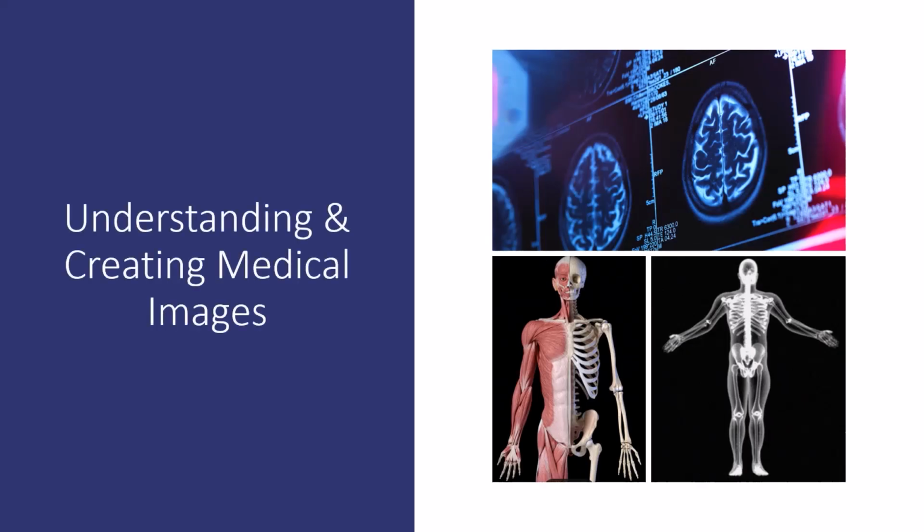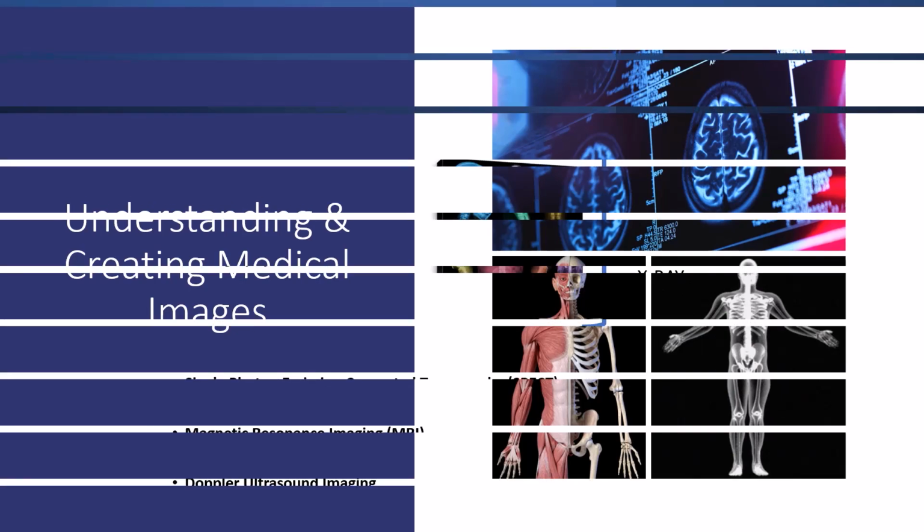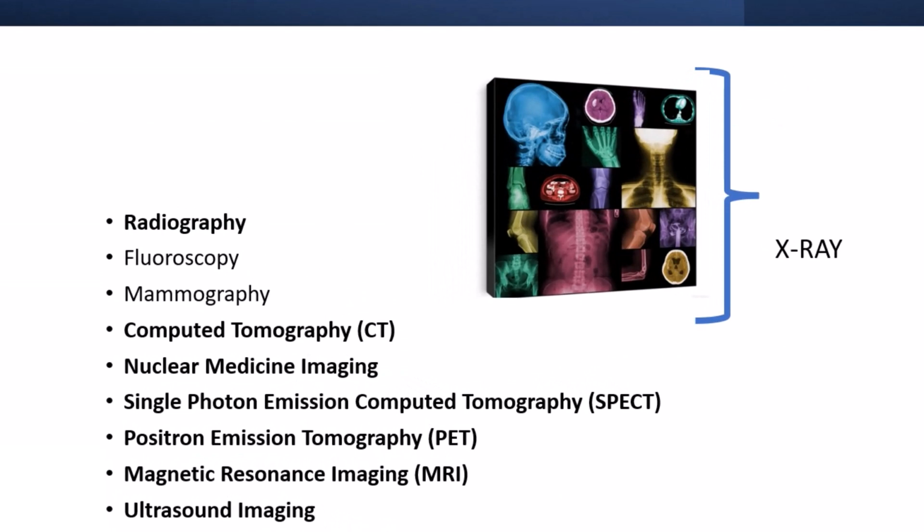Today we're going to take a look at the different types of modalities and what they're used for and why. In creating medical images, we can use X-rays, gamma rays, radio frequency waves, and sound waves.